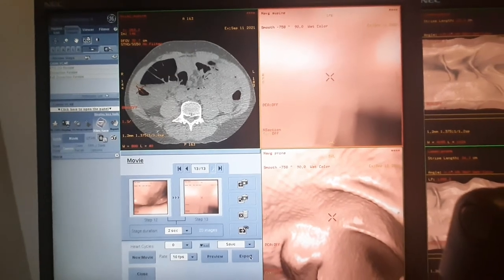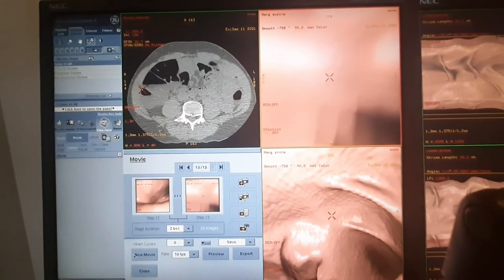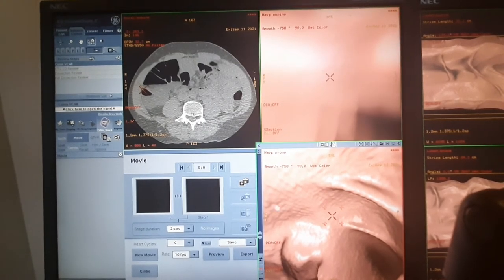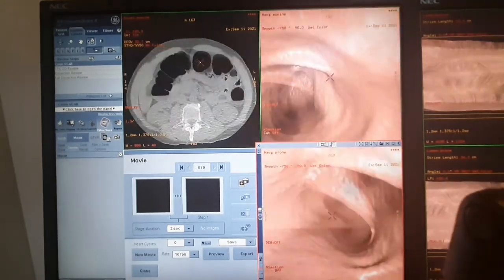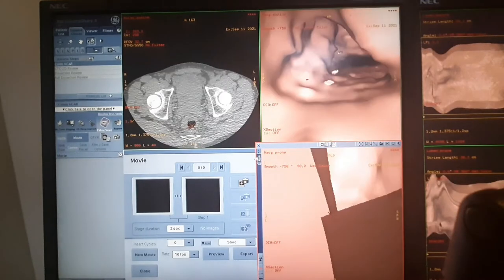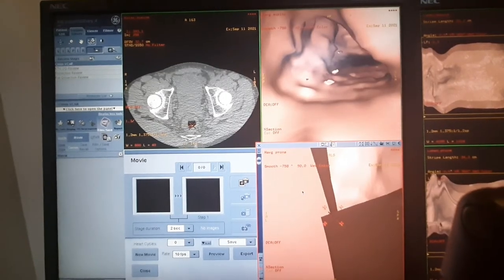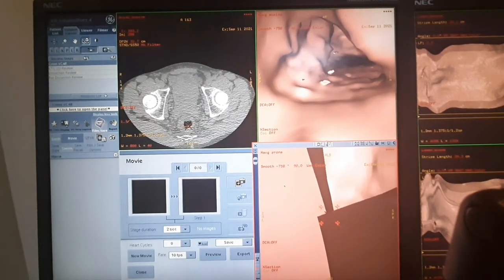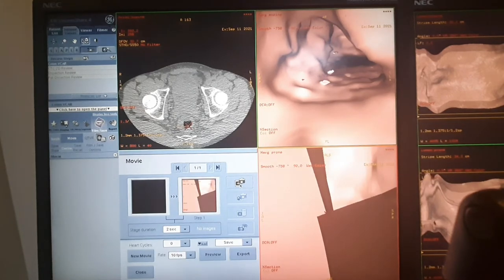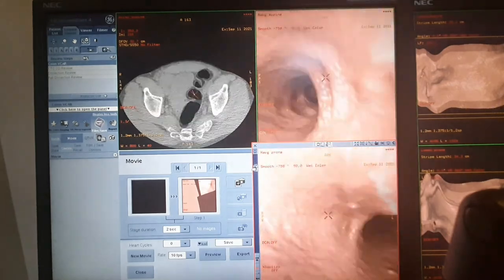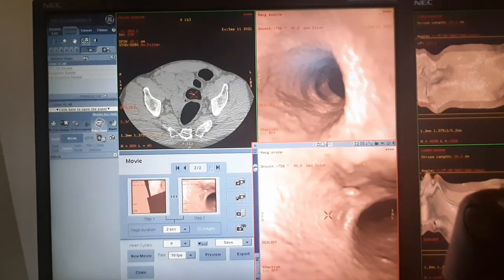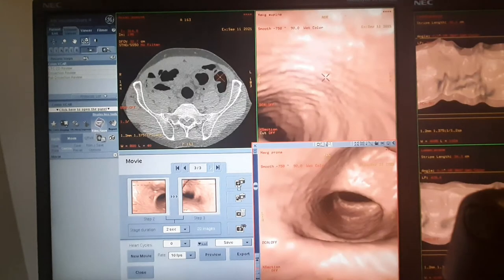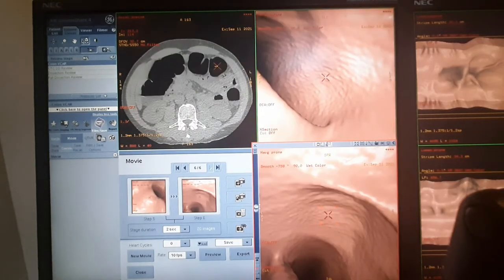Now I'll click New Movie and start with the prone. I'll pull the bar again and put it at the start location at the rectum. Highlight it and again I'll do the capture batch by batch — you can capture the same way I did for supine. I'll do the same for the prone position using the same approach.